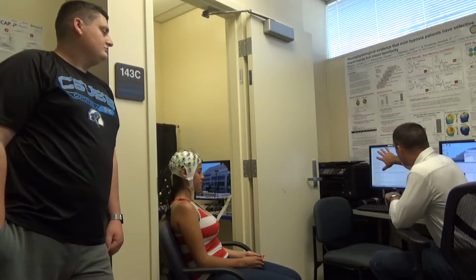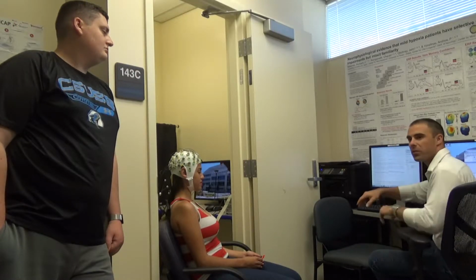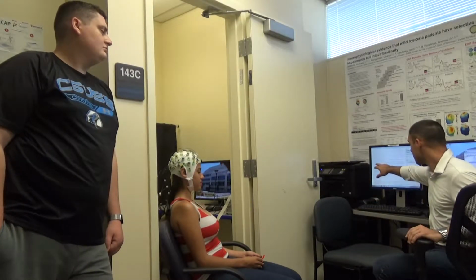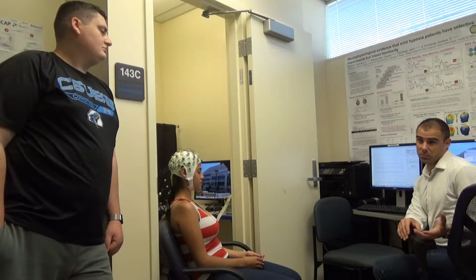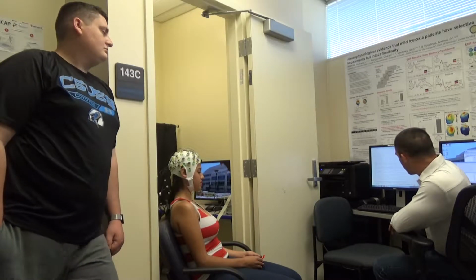And we can see though that while she's got her eyes closed, everything is basically pretty still. We do see some of these alpha frequencies, which aren't necessarily artifacts. We know they're neural, but they're not really what we want. When we saw those in our experiment, maybe that meant our subject took the trial off, closed their eyes and maybe dozed off for a second or two. So this is our starting baseline level of very calm, relaxed brain activity, which might also have some theta or delta frequencies, very low frequency oscillations associated with relaxation or deep meditation or sleep, things like that, okay?